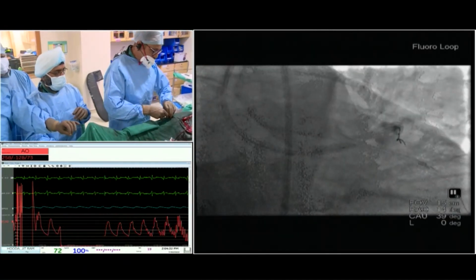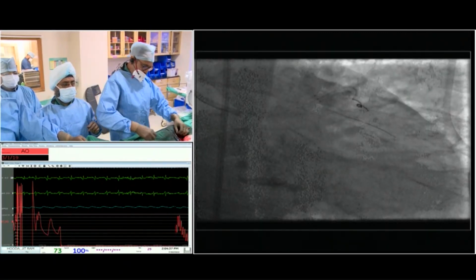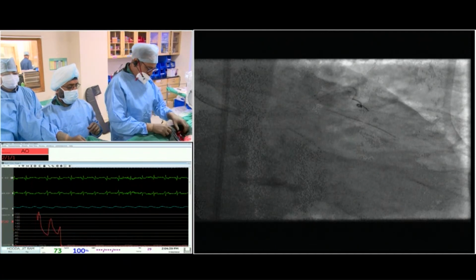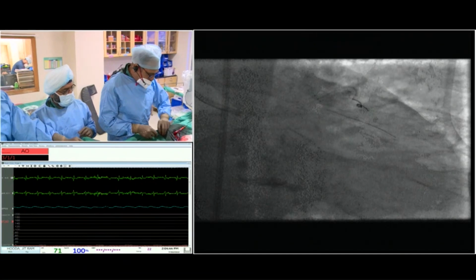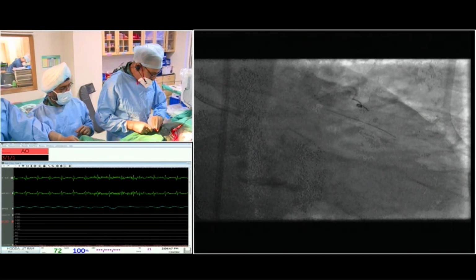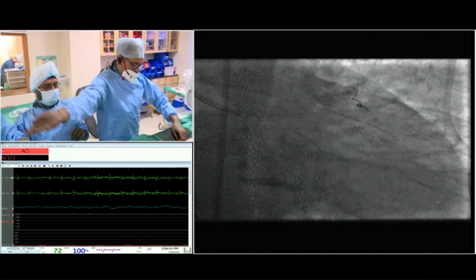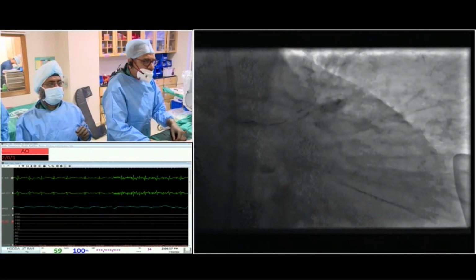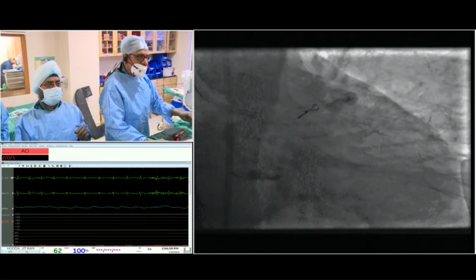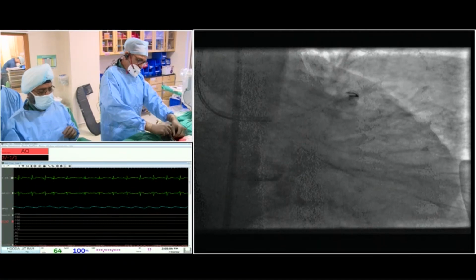So I used the Onyx stent here, as per the EBC MAIN, where this was the stent used. There's a new study with an interesting name, the Rolex study, in left main, also done with Onyx, not the Rolex watch. They said this bigger size Onyx can expand to 5.2, and they showed results in about 450 patients that were quite good. But at the end there are follow-up event rates of about 2%, which is still high in today's era.